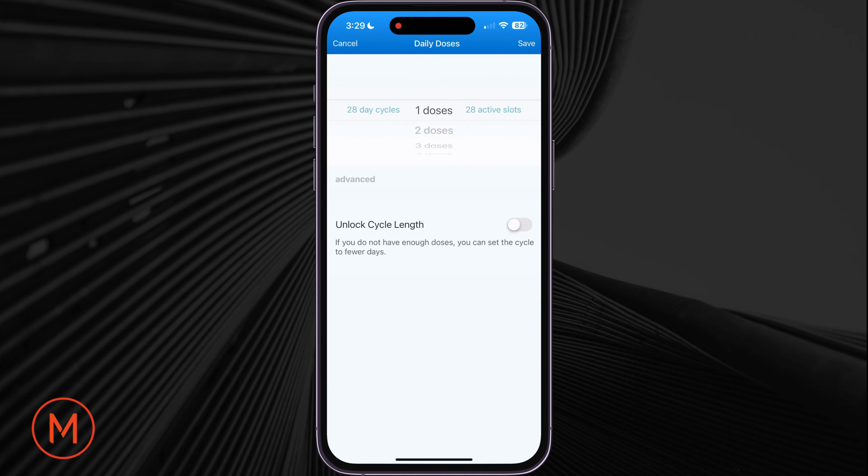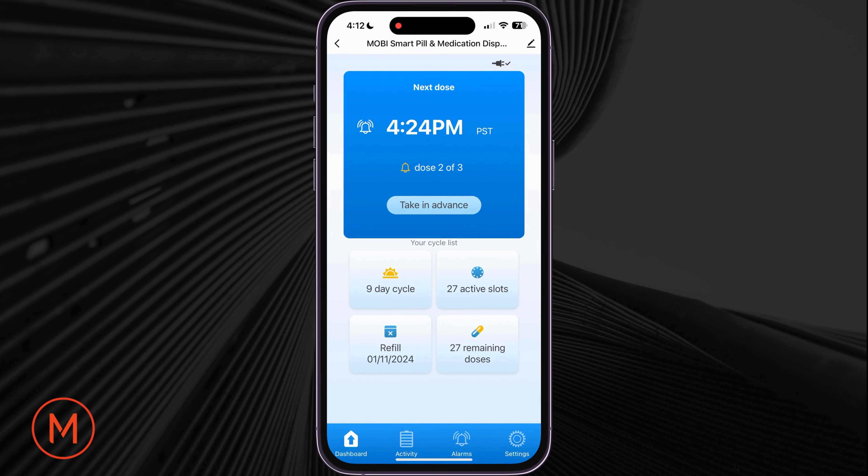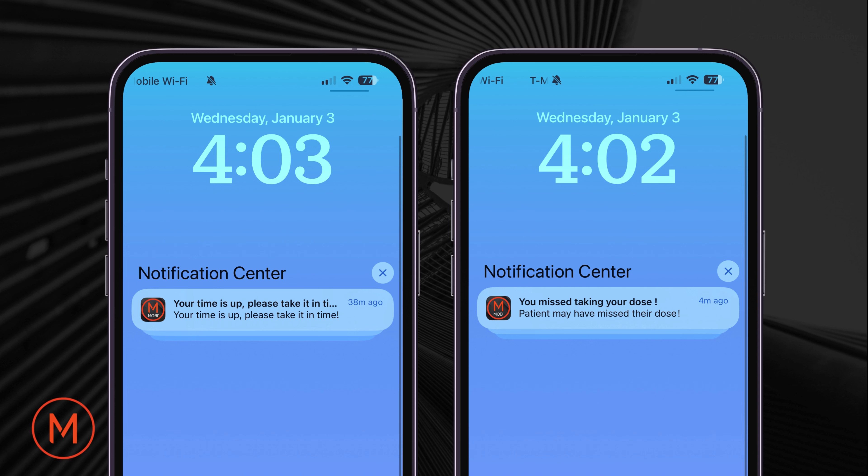If the patient does not have enough doses for a month's time, select Unlock Cycle Length and input the number of cycles possible with your quantity of medication or vitamins. When the pill dispenser sounds the alarm, you will have the ability to silence the alarm, take your next dose in advance, and receive smartphone notifications for when it's time to take a dose or when the patient may have missed their dose.